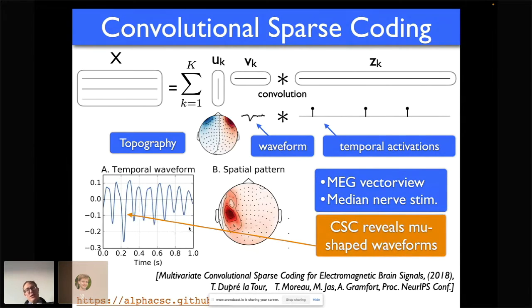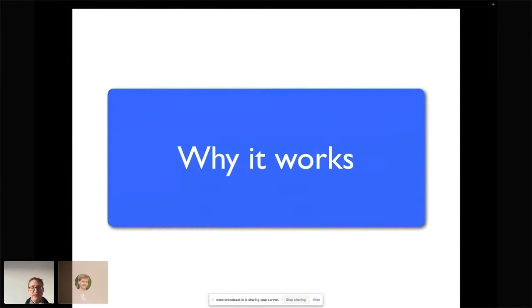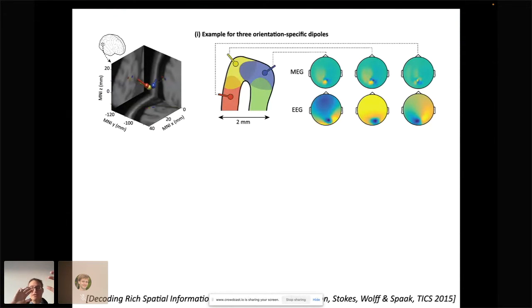All right, so why do these types of techniques work? If you step back a bit, what we are really leveraging in all the examples is the array of sensors. We have many electrodes, and all of the electrodes are positioned in slightly different places. In order to decode one condition from the other at a given time instant, like when we did time-by-time decoding, what mattered is which feature captures the signal, and in this specific case which feature is which electrode, which sensor, depending on where it is.